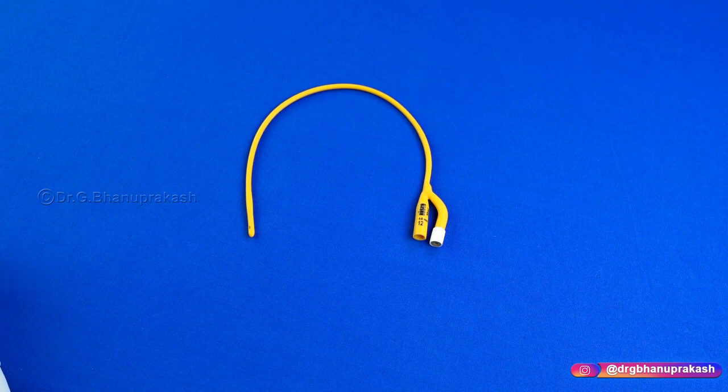First thing, guys, a Foley's catheter is basically used to drain urine out of the urinary bladder. So for those patients who cannot voluntarily urinate themselves, we use a Foley's catheter. We also use it for patients who are bedridden. First of all, let us discuss the different parts of a Foley's catheter.